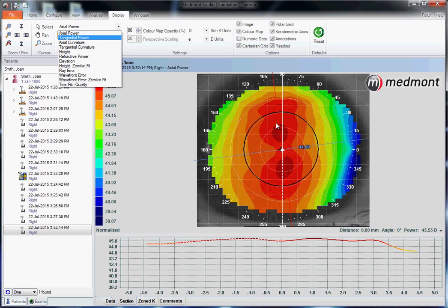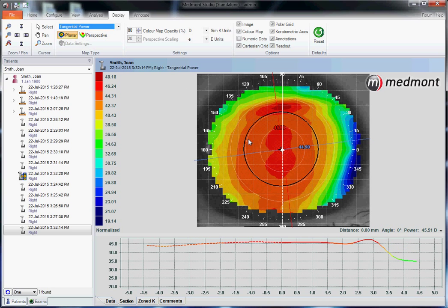This patient has with-the-rule corneal astigmatism. We see the steep meridian running vertical — it's very regular. The superior hemisphere is a mirror of the inferior, and the nasal a mirror of the temporal. We could switch to tangential to understand the shape of the eye. Looking at the contours, this cornea appears displaced slightly inferior and temporal on this right eye, with each hot contour pulled inferior temporal.